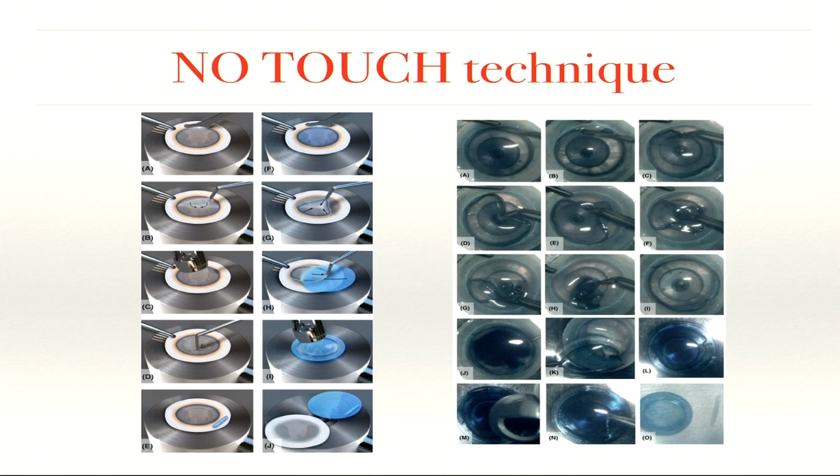So this is just an illustration showing the no-touch technique popularized by Melles. This is the traditional technique in which you are stripping and holding the edge, but in this you're basically stripping from the periphery all throughout the entire Descemet's membrane, and then you're transferring it over a contact lens, and then the contact lens is trephined to appropriate size.